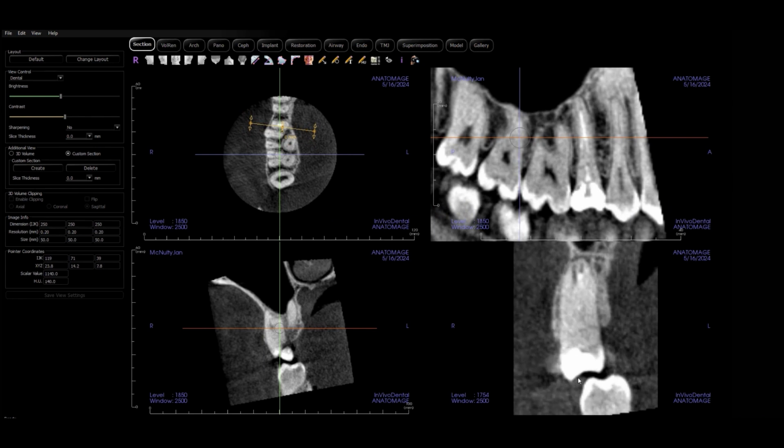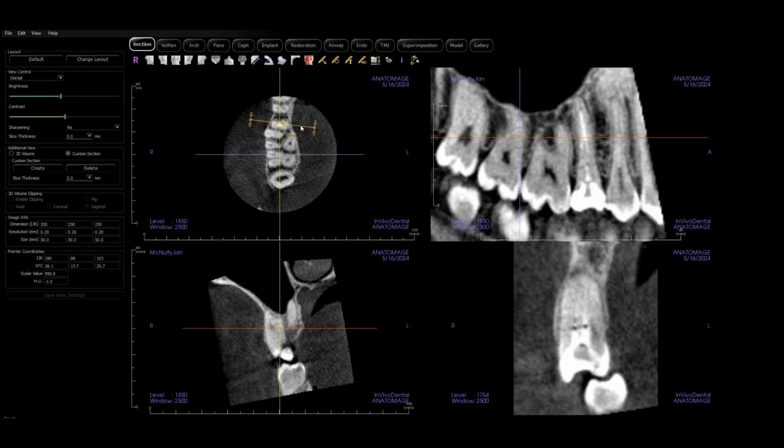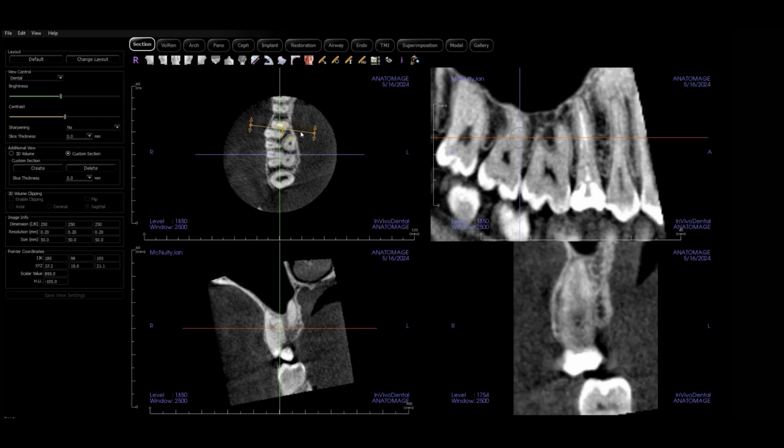Upper premolars, I always flatten this cusp, get that out of potential lateral excursive interference. Obviously going to put a crown on it, but in the meantime, it's always good to get rid of these sharp edges just to prevent a fractured root from happening.